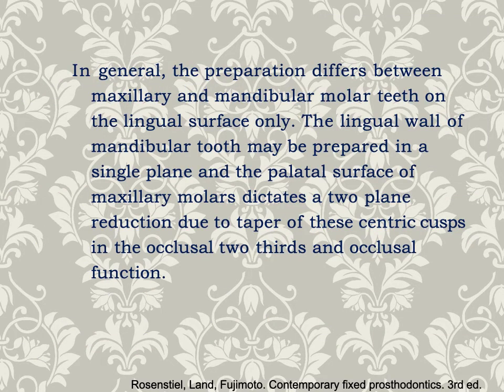In general, the preparation differs between the maxillary and mandibular molar teeth on the lingual surface only. The lingual wall of the mandibular tooth may be prepared in a single plane, and the palatal surface of the maxillary molars dictates a two-plane reduction due to taper of the centric cusp in the occlusal two-thirds and occlusal function.